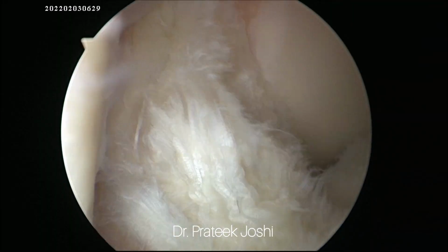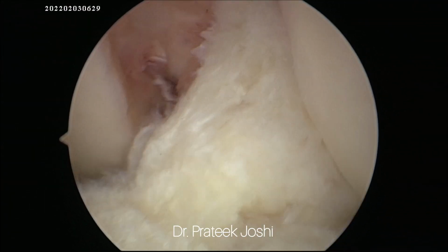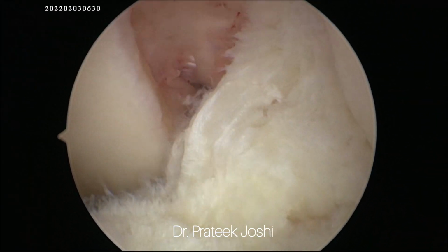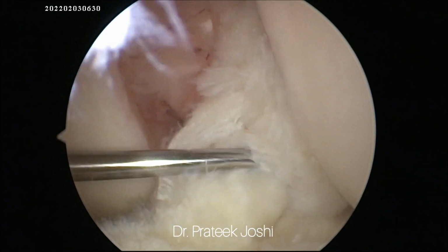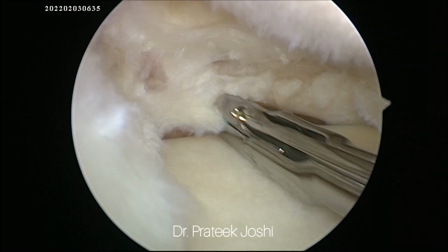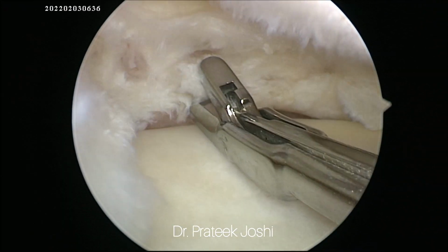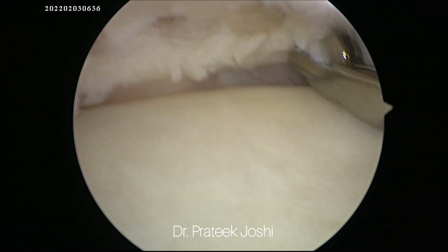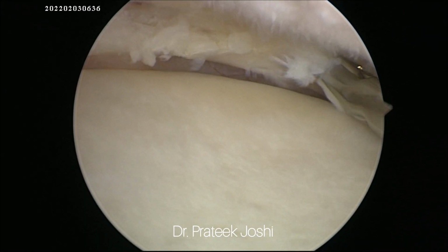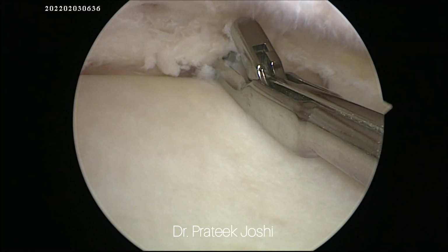So this completes arthroscopic ACL debulking for the mucoid degeneration of the ACL. And now as we go in the medial compartment of the knee joint, we are going to encounter the medial meniscus, posterior horn, and the body tear. So this is a picture after we have cleaned the frayed cartilage over the medial femoral condyle and the proximal tibia on the medial side with the help of an arthroscopic shaver. And now we are gently debriding or removing the inferior lamina of the torn medial meniscus, posterior horn, and the body.